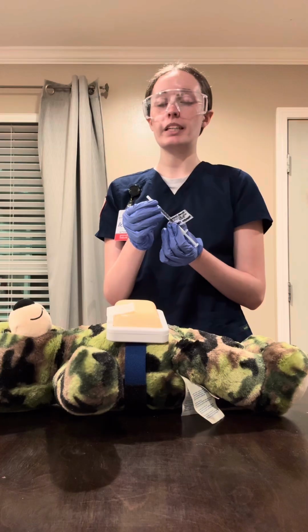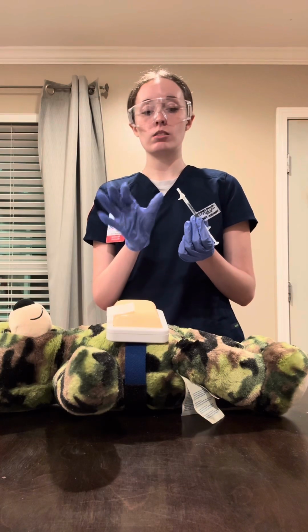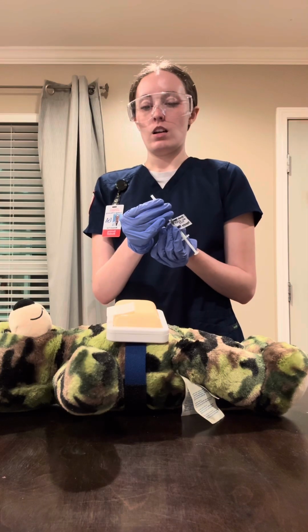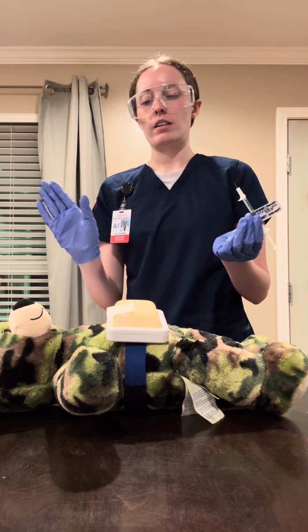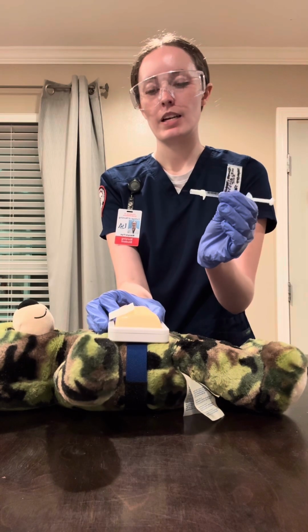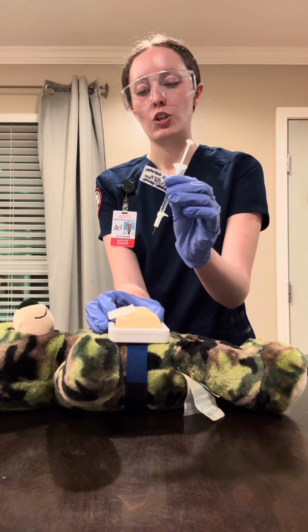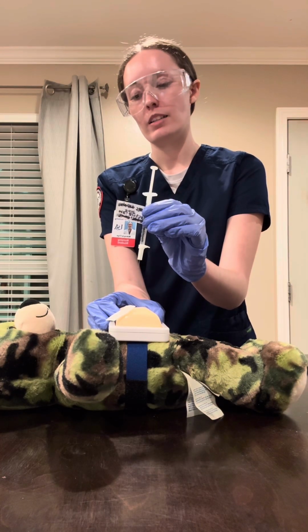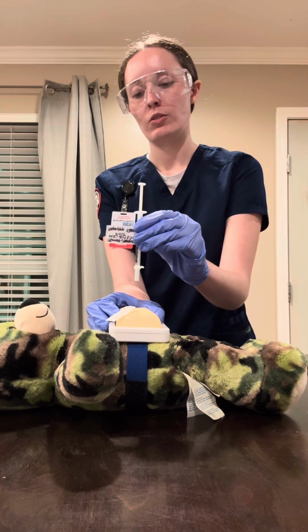And heparin should be given over 30 seconds for the whole injection. So let me know whenever you're ready. I'm ready. Okay, perfect. So let me squeeze the skin really quick, and I am going to count down for you, okay? 1, 2, 3.